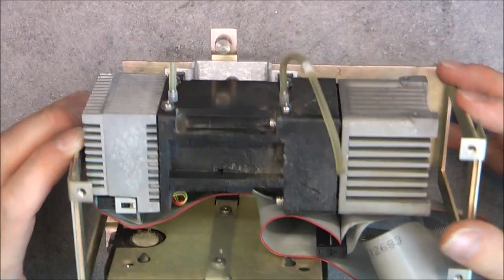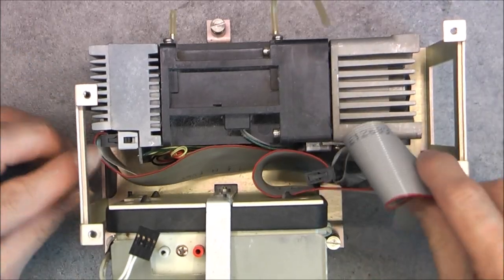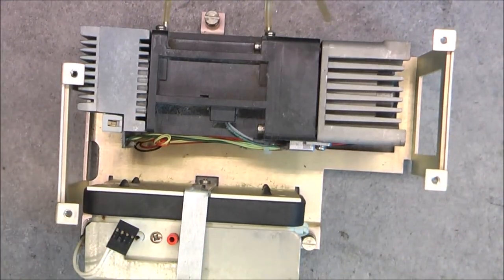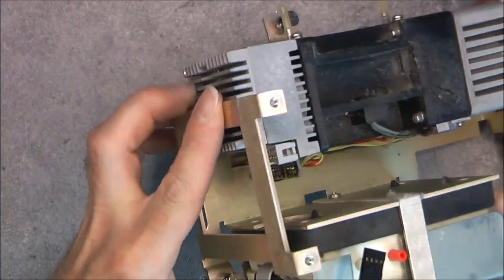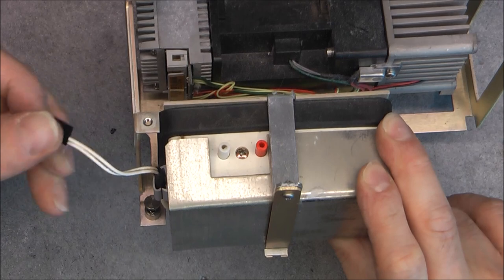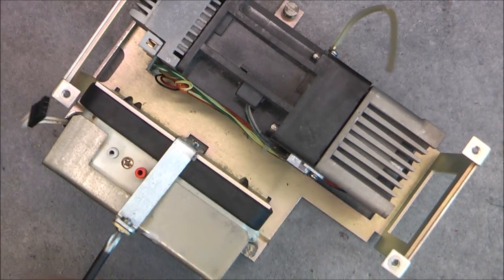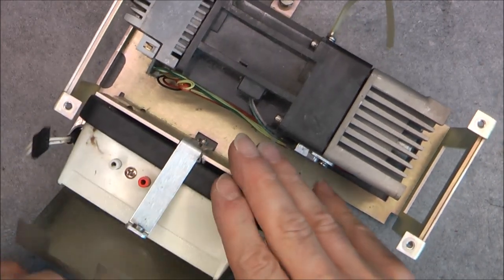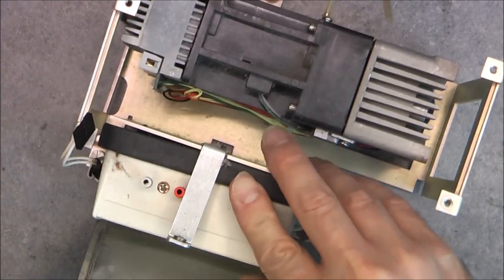And we are left, I believe, if I do not forget anything, yes. We are left with the most interesting part, the pump and gas sensor. So above this gas sensor, we have a big cable again, out of the way. This is very obviously only a pump, because you have two air connections and one two wire electrical connection to it. So surely not a gas analyzer, and you need a pump somewhere anyways, so it must be this.